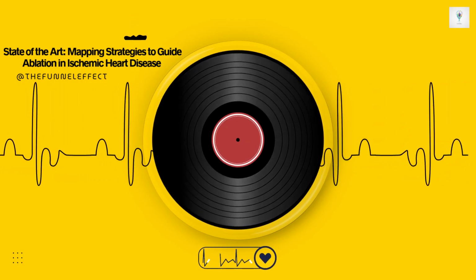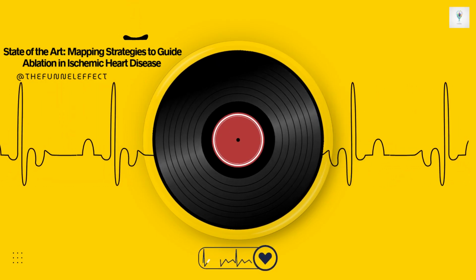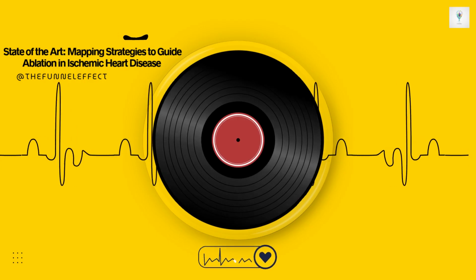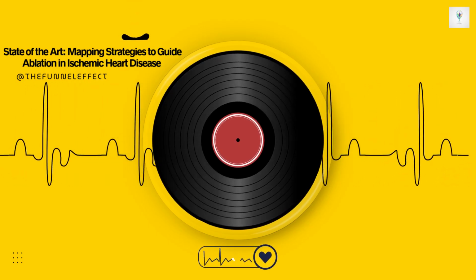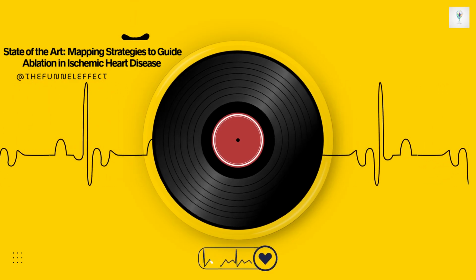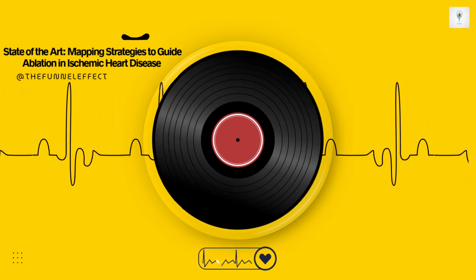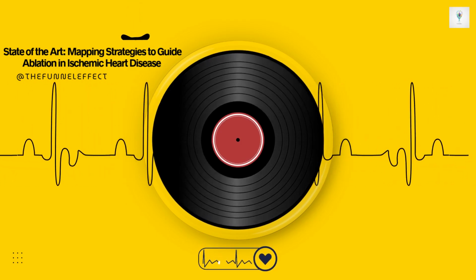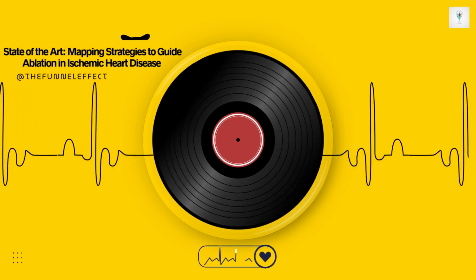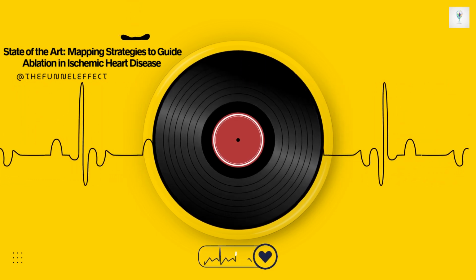Okay, so before we even start deploying these mapping tools, there's some upfront planning. Let's talk workflow. How useful is pre-procedure imaging, like MRI or CT? Pre-procedure imaging is definitely valuable, though maybe not strictly essential in every single case. MRI, particularly with that late gadolinium enhancement, LGE, it's excellent for showing where the scar is, how big it is, its overall shape. We can actually take those MRI images and import them directly into our 3D mapping systems in the lab. Like a roadmap.